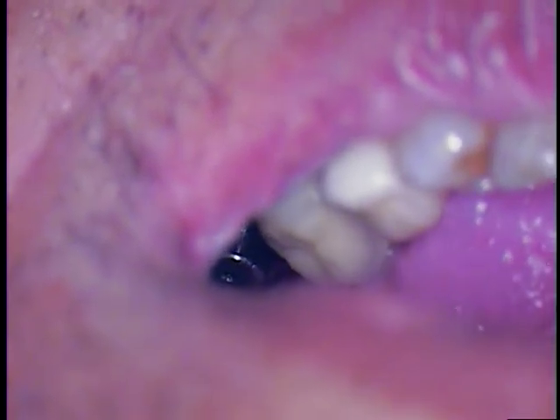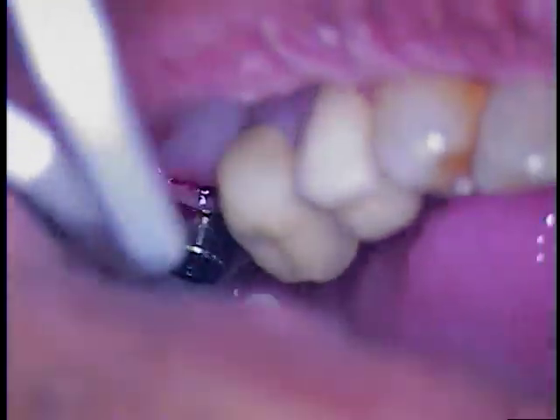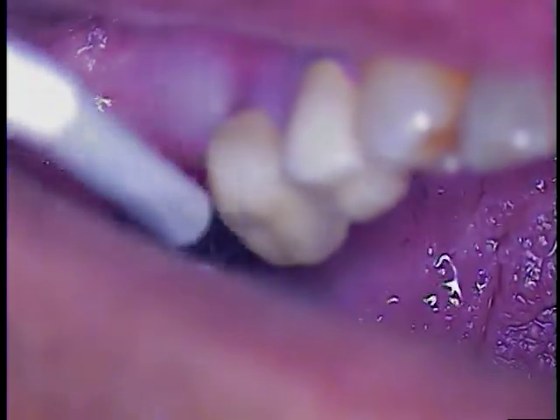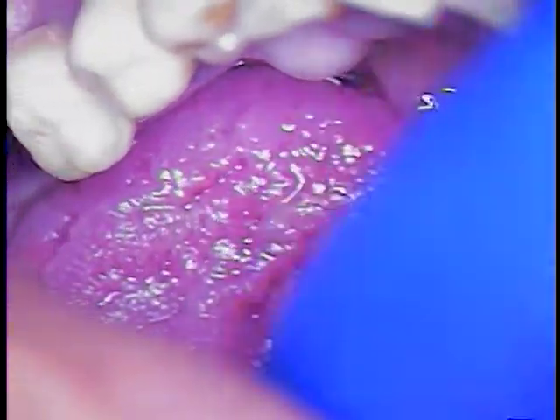Let's just reach in here again — there might be one hiding. Let's go carefully. There it is, just rub that. There we go. I think I'm going to put this back in on this side, just rest on that.